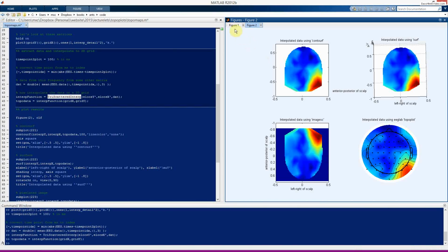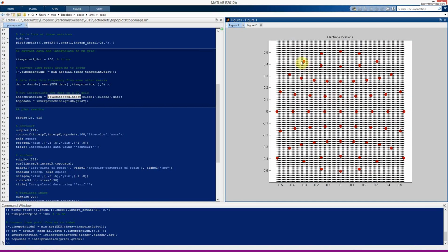It doesn't do extrapolation. And what that means is that here is the boundary where we recorded our data, and anything within this boundary would be interpolation. Anything outside this boundary, it's not possible to interpolate because there's nothing to interpolate to. So instead, estimating a point out here would be extrapolation.